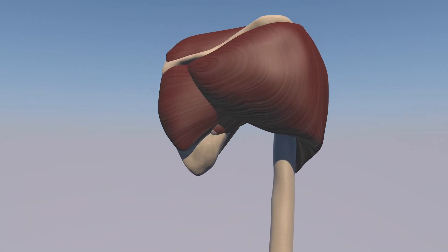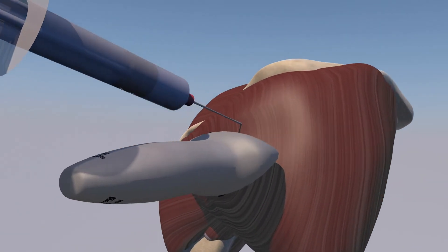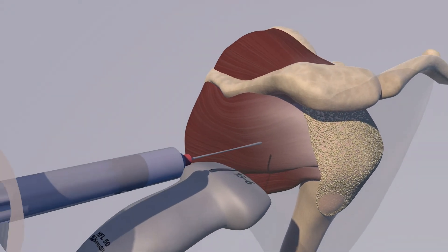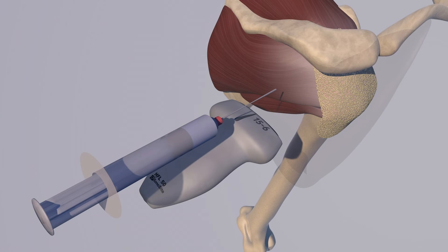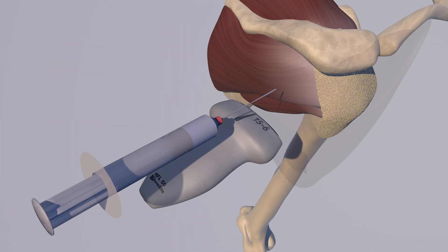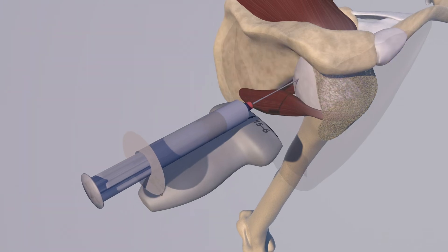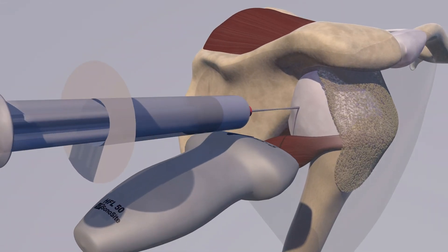Here we're going over a glenohumeral injection with short access to the needle. You can see how the needle is essentially above the probe, and the probe is in an axial plane posteriorly over the infraspinatus and deltoid musculature. We're making the deltoid translucent, and from a bird's eye perspective the needle is lined up with the mid aspect of the probe. Now we're going in and doing a little jiggle technique so we can see tissue movement during the procedure to localize the needle.